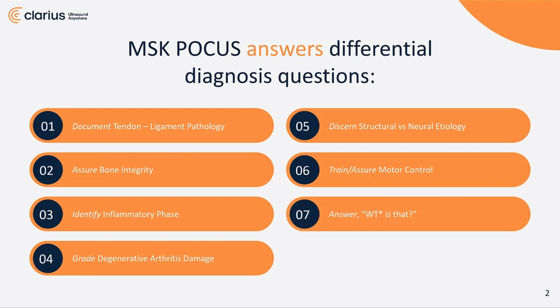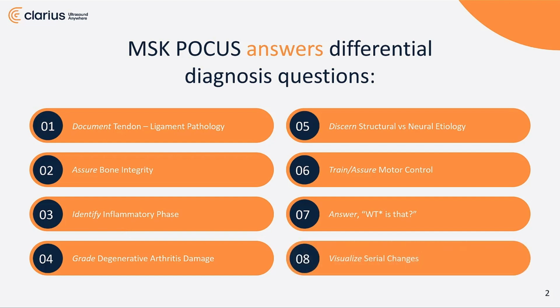Number 7, probably one of my most favorite ones and the ones that I have the most case studies on, and that is when a patient comes in and says, "What is this?" The answer that we're able to actually show the patient under ultrasound imaging has credibility that's beyond amazing. And lastly, as we take a look at, is this healing happening correctly? Do we see remodeling? Or is there continuing indications that there's an infection process going on?